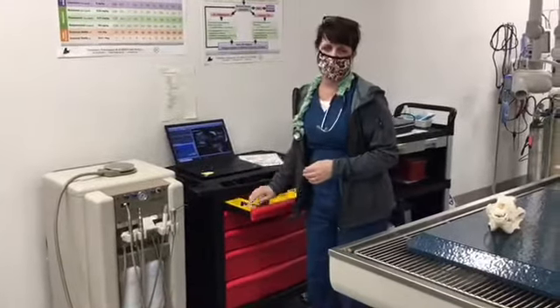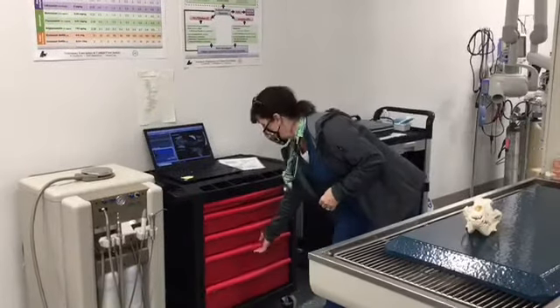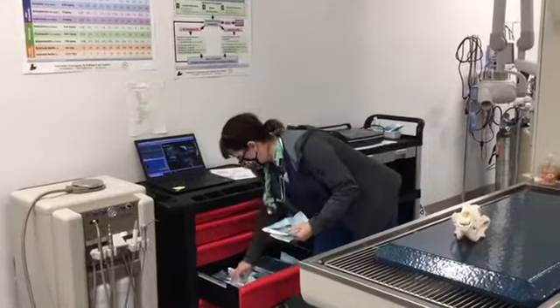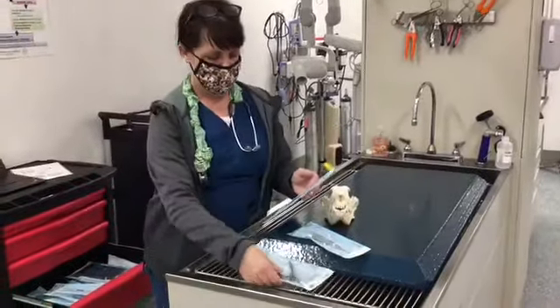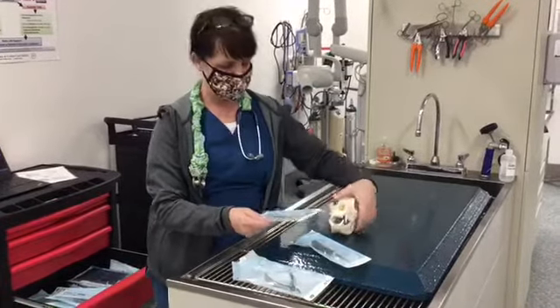Sometimes an animal needs a tooth pulled because it's not healthy. And so we have all kinds of instruments here that we use to pull teeth. And so these here are sterilized just like in surgery, so they're nice and clean for each new pet.